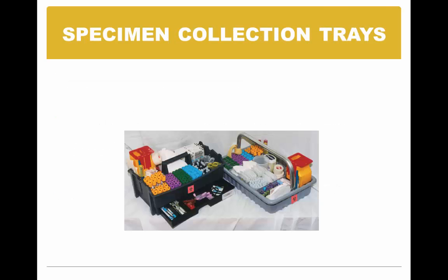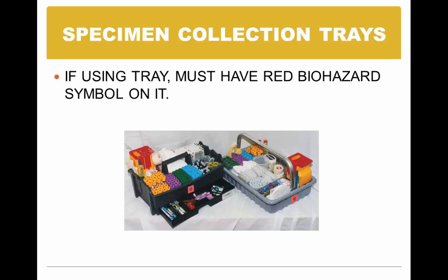You might see specimen collection trays. So if you're using a tray, it has to have a red biohazard symbol on it. Okay, because of the possibility that you could have contaminated blood there or on it or something like that, and you have to make people aware.